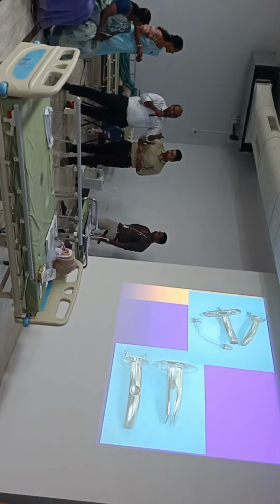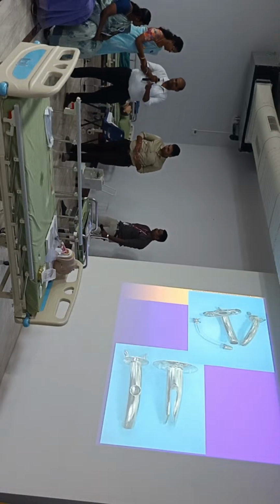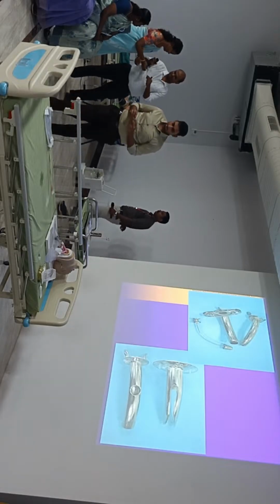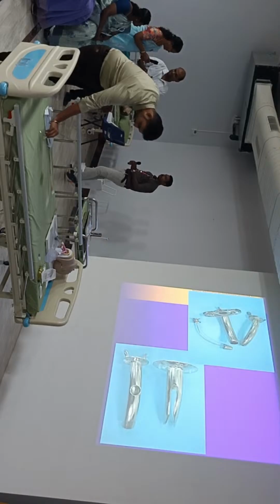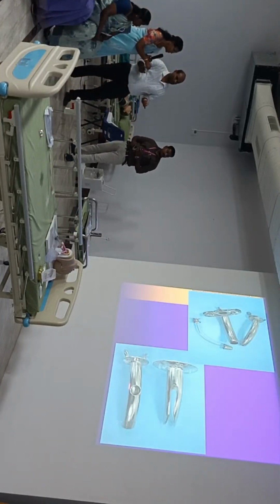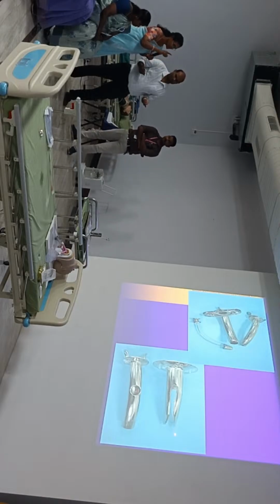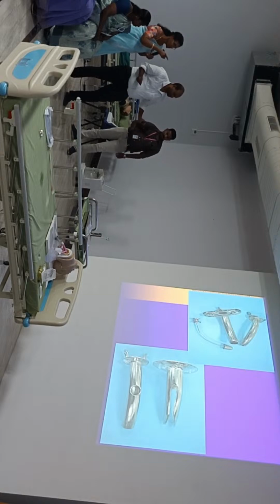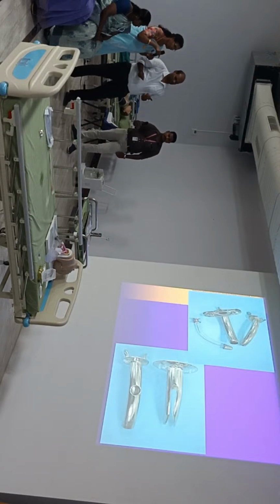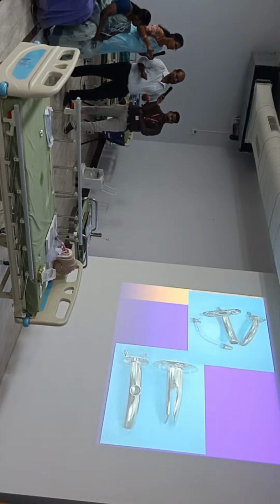The same trocar is available in the plastic tubes also. So this is a trocar. We insert it, take it out, then put the metal tube. What is it? This is the fenestration, I think. It's an inner tube, and this is the outer tube, and it shows in the display it is 32. It is for the female, and we can use it for male also.